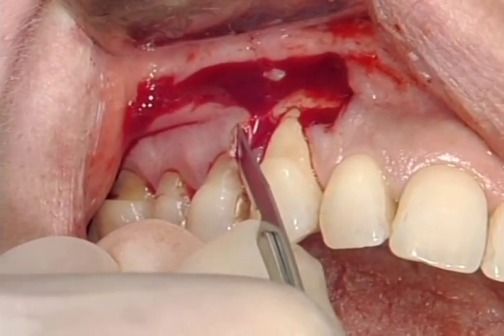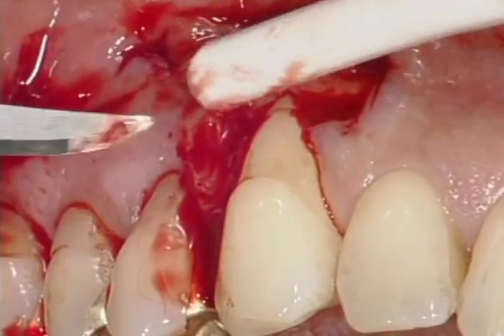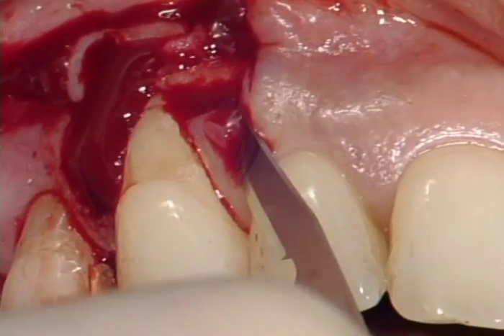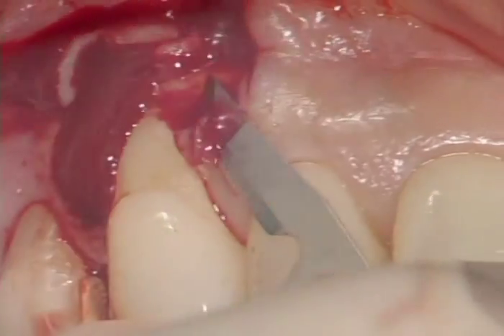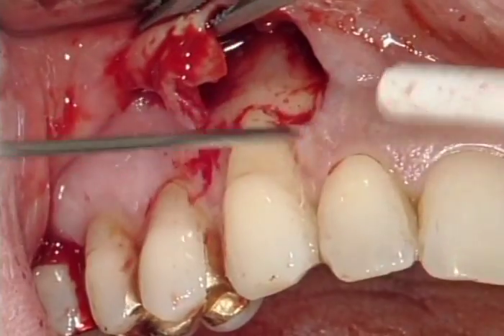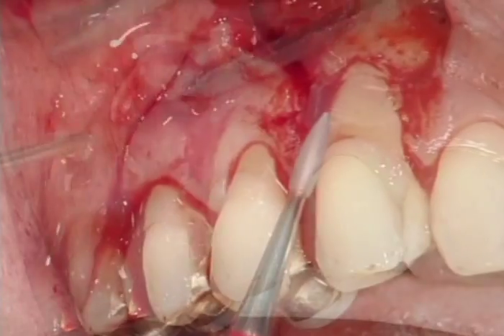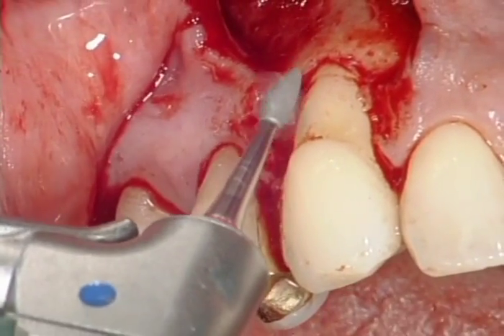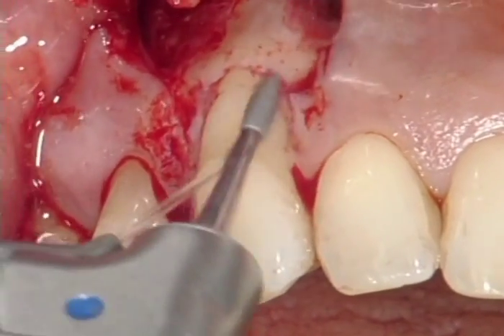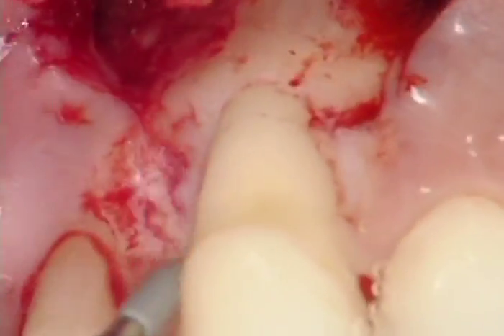To create a connective tissue bed for suturing the coronally advanced flap, the buccal aspects of the interdental papillas are de-epithelialized. To ensure the removal of any plaque, calculus, or other irregularities, the root surface is cleaned and smoothened with a periodontal file.